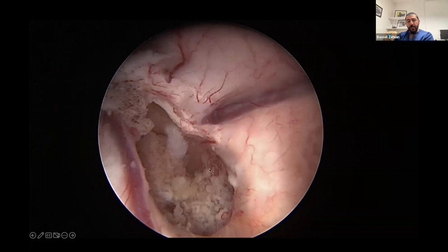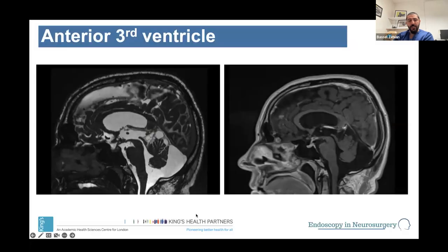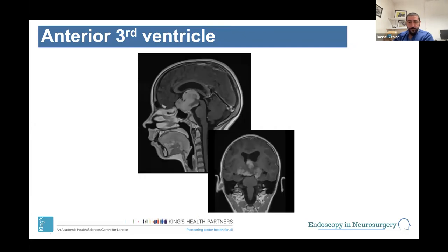And there, that's the tumor that you can see better. And then we left a small residual. That residual grew over time. So they ended up going for, children would normally go for proton beam therapy. He went for the radiotherapy.